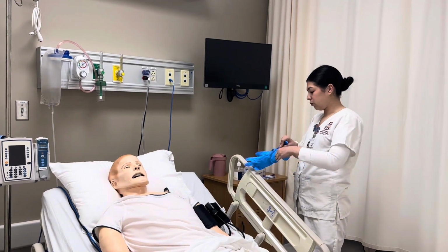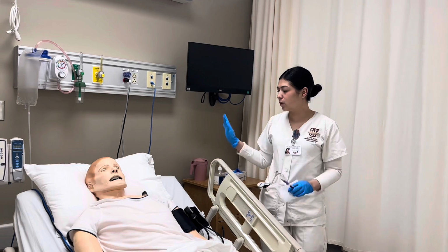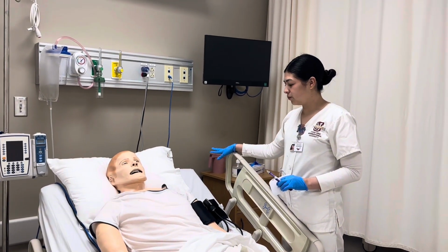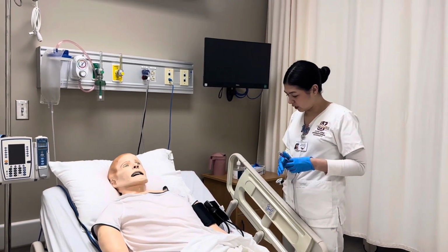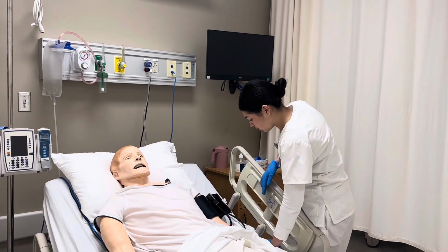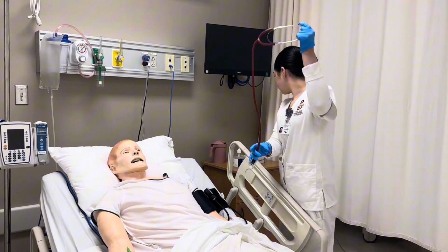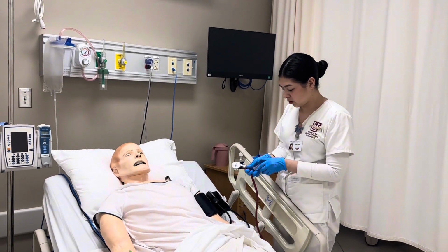So I'm gonna go ahead and put on my gloves and take a look. Okay, so I'm gonna be checking the patient's appearance, facial expression, and their posture as I'm assessing them. So first I'm gonna take their blood pressure. I'm gonna sanitize the stethoscope.